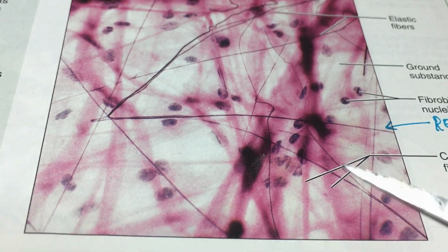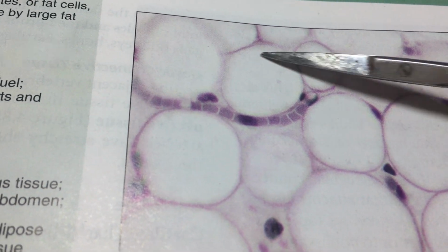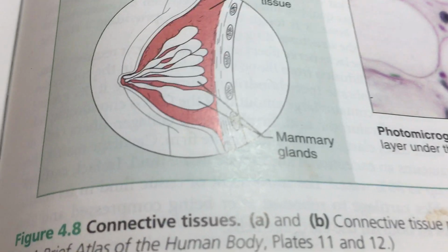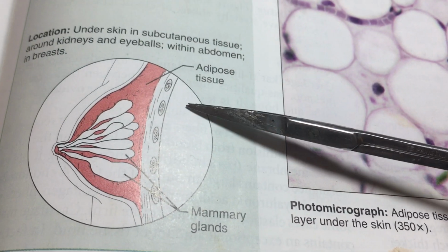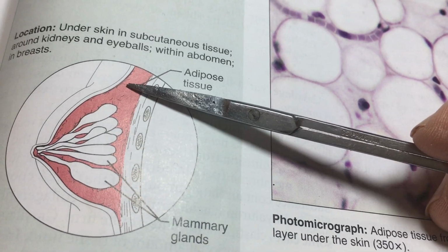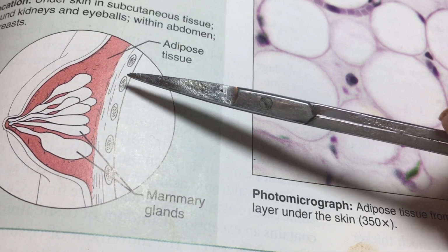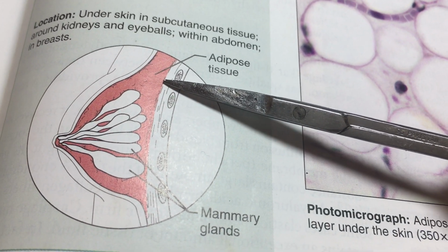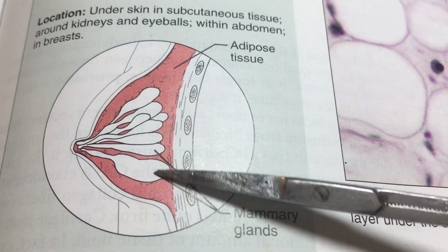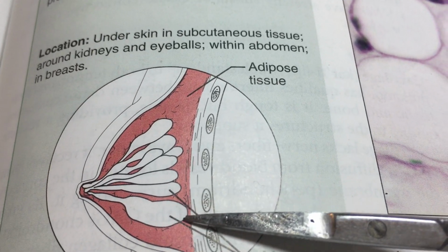So that's the situation with that. Now the invasion of loose connective tissue with adipose tissue is common, and so this is usually included. Here we've identified this as the tissue that will be beneath the skin, so of course the skin moves readily across the underlying muscles and tendons and so on. In the case of breast tissue, we're going to be having the glandular development of milk-producing glands right here.